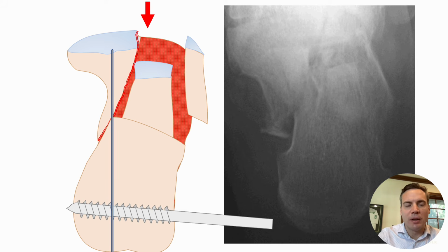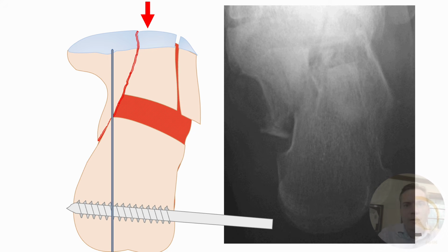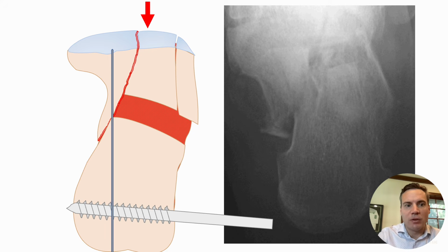Now we can come in, we can elevate the joint depression, we can push the lateral wall back, and then we can use the sustentaculum screw to compress this joint all the way into the sustentaculum. Now you can see in this piece here, we have some crushed, some missing space, and this is where oftentimes we'll place some cancellous chips.